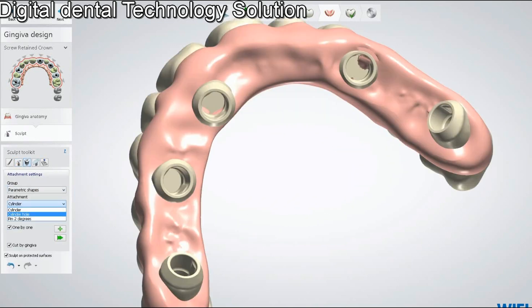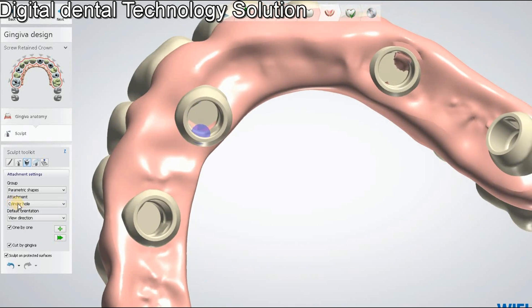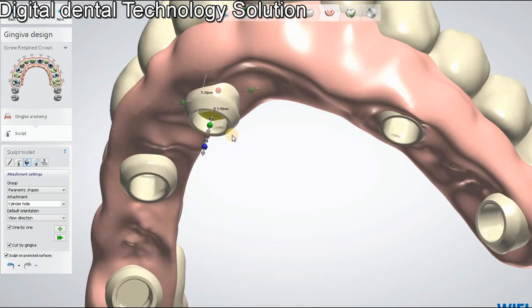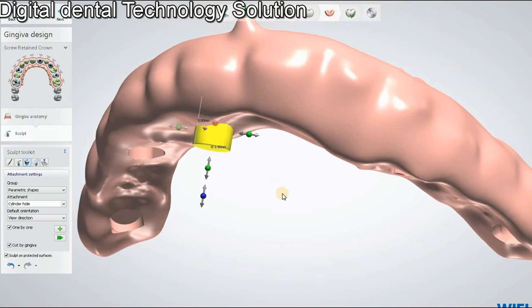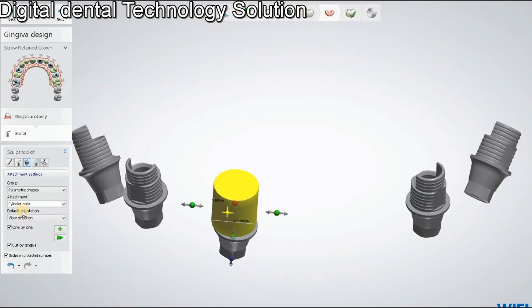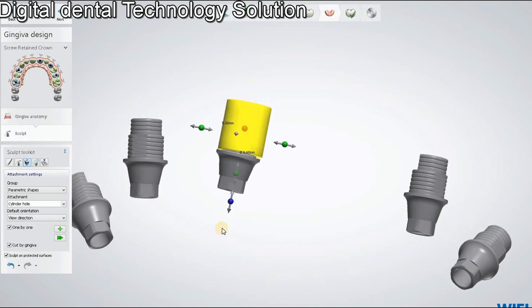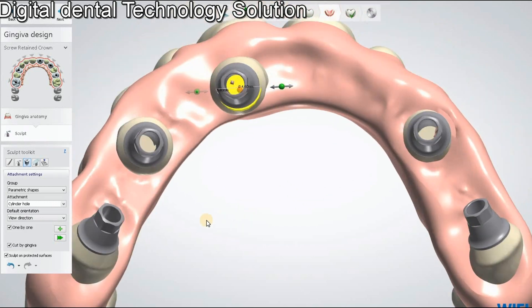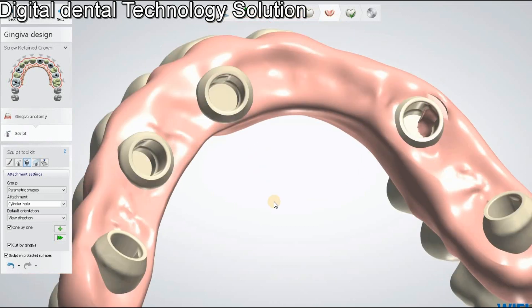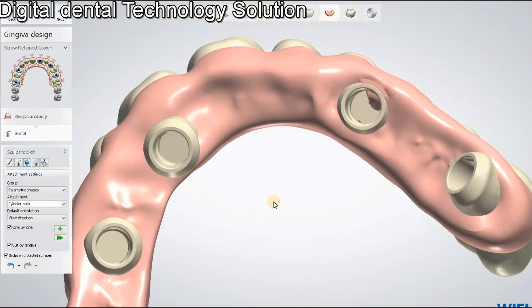As you can see, there are some areas that are protected — we cannot sculpt them directly. We can use the cylinder hole attachment to sculpt those areas. If any part is protected, we apply the cylinder hole attachment to remove that protected area from our restoration. We apply the same approach throughout.